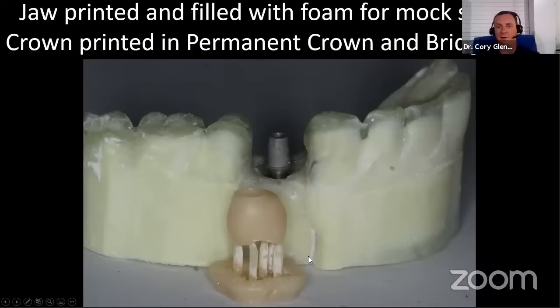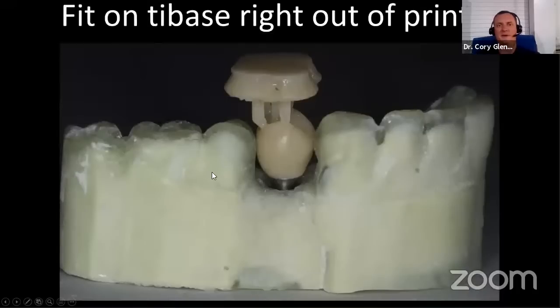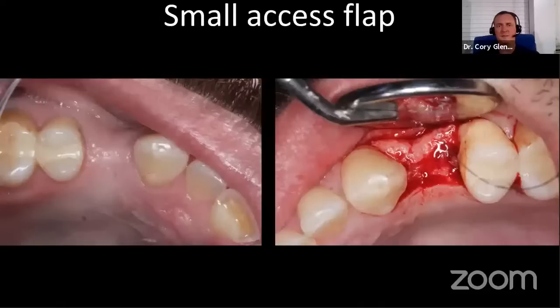And in theory, if all of this worked right, then this printed crown, which I've not even tried on yet, should drop right onto that with ideal contacts, ideal occlusion, all of that. And sure enough, it did. Straight out of the printer, this was no adjustments or anything. So I'm just going to remove the supports and go ahead and bond that in place.